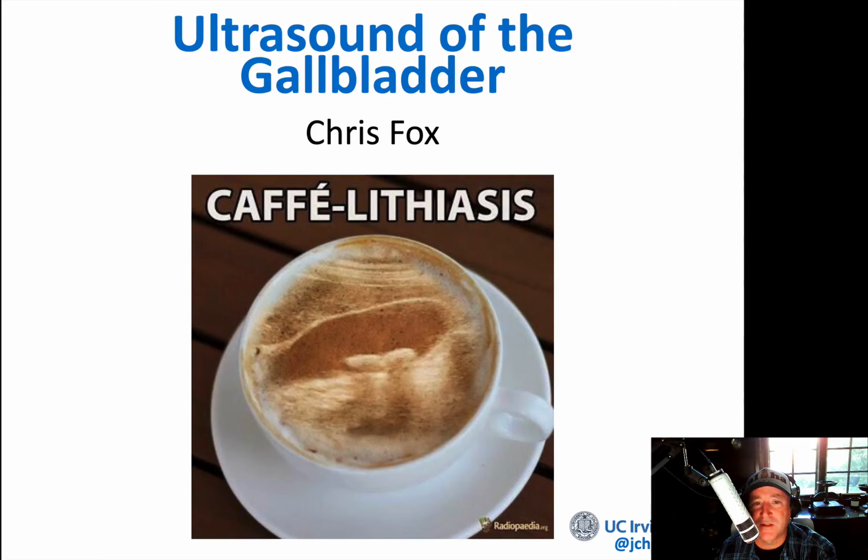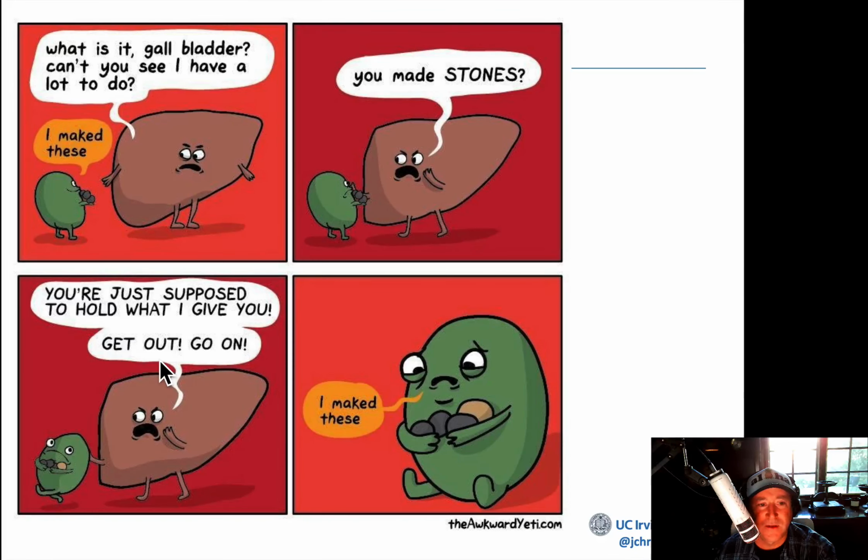Okay, so we're going to switch gears. We talked about small bowel obstructions, talked about appendicitis. We're going to talk about gallstones now. This is, gosh, in my patient population, this is like three times a day I'll make this diagnosis.